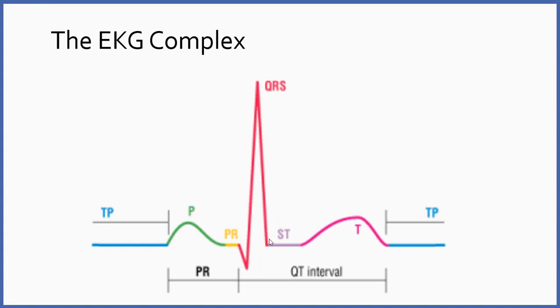Sometimes you'll see a waveform that does not have a Q wave. It just starts out with the R wave, and basically we have an RS. That'll get important if you take a 12-lead EKG class. It's sort of picky, but for us, we just refer to this whole chunk, regardless of whether it's got the Q wave or not, as QRS.